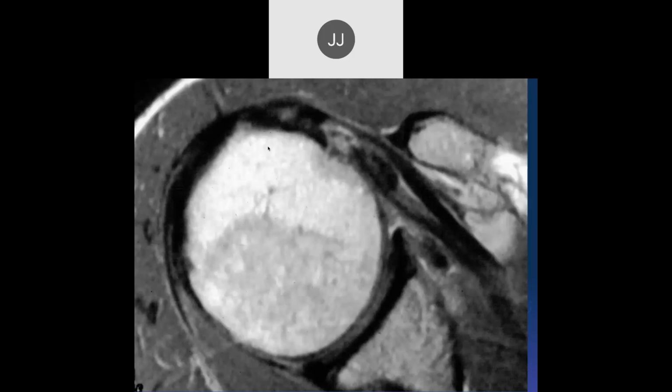Okay, direction of instability: anterior, posterior, anteroposterior. Extent of instability: none, subluxation, dislocation, no numbers. Lesion grade: normal 0, minor lesion 1, major lesion 2. Rotator cuff tear/lesion: A intact, B partial thickness, C full thickness. That's it.